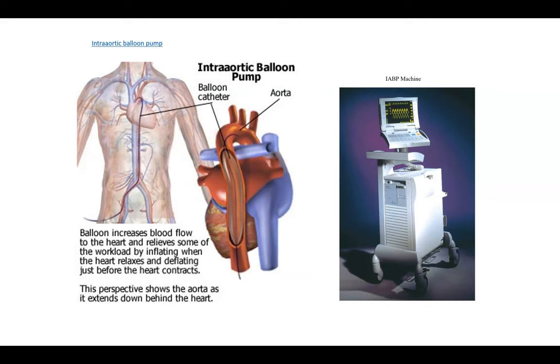That is the length that we take for the IABP pump. So you put in that length. If you do that, you almost arrive at the same point. That is for those that cannot assess the subclavian artery or measure it by taking an angio. That is another way to look at it. For example, you want to push in an IABP in the ICU without taking the patient to theater. That is the way to get it done.